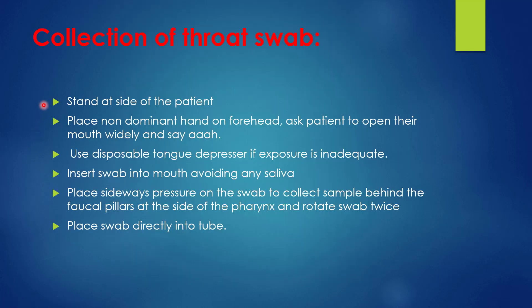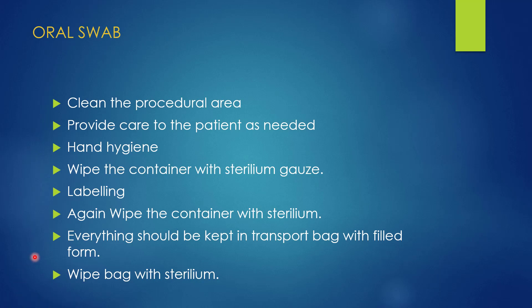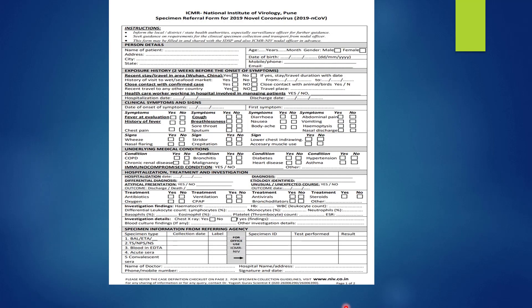The same process applies to throat swab collection. Stand on the right side of the patient. Place the non-dominant hand on the forehead and ask the patient to open the mouth. If exposure is inadequate, use a disposable tongue depressor. Insert the swab into the mouth avoiding contamination with saliva, and rub on the posterior pharyngeal wall, tonsillar pillars, and tonsillar fossa. Seal the swab into the container with viral transport media, label it properly, sterilize with alcohol-based sanitizer, and insert it into the transport bag with foam. Clean the transport bag with alcohol-based sanitizer.